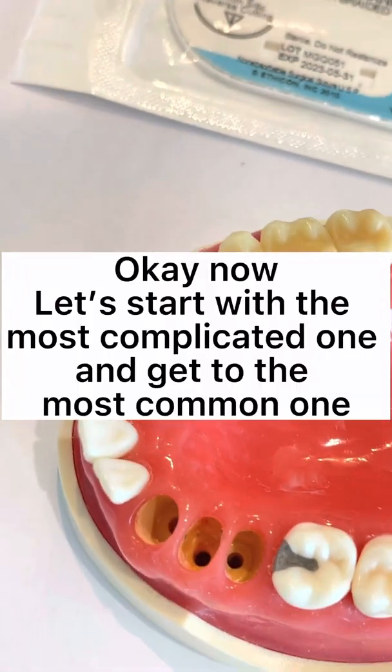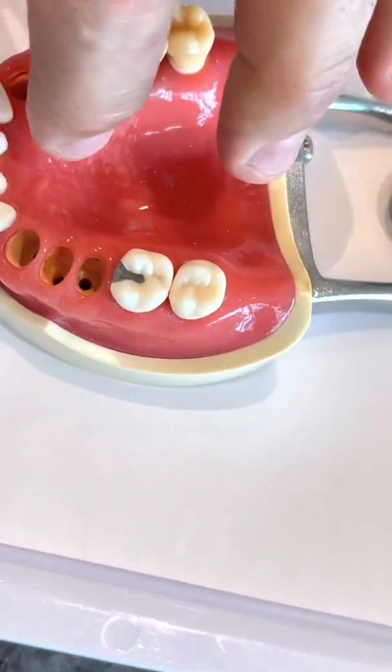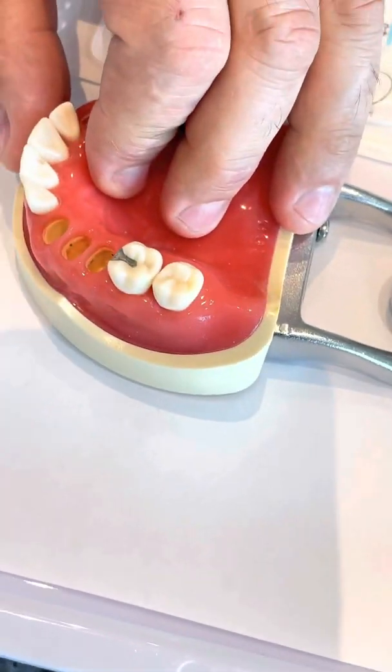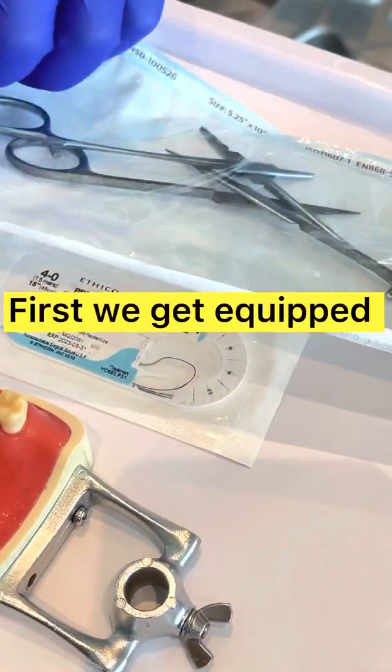Now let's start with the most complicated one and get to the most common one. First, we get equipped.